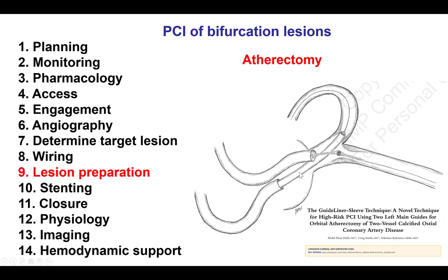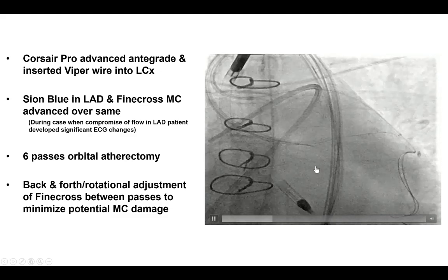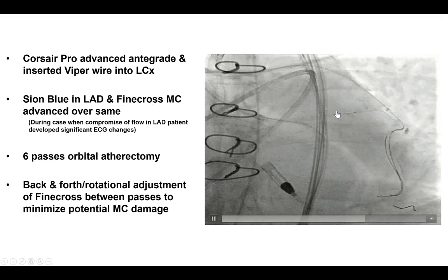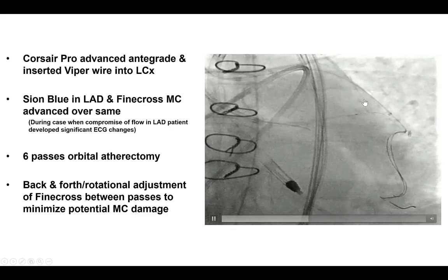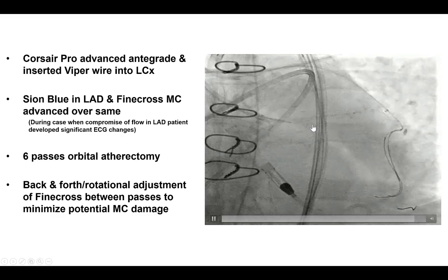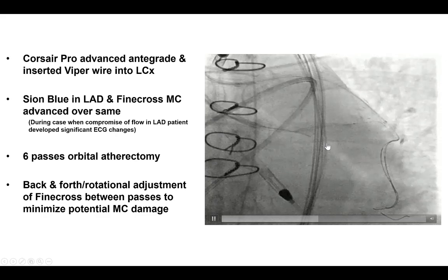One way to handle this is to use two guides and use a guide extension to protect the wire in one vessel while performing atherectomy in the other vessel. The other option is to use the guide extension over the wire used for atherectomy to protect the secondary wire into the side branch. What we did in this case was to insert a FineCross microcatheter over the LAD wire to protect it, then perform multiple orbital atherectomy runs into the circumflex. While doing that, we changed the position of the FineCross to minimize injury at the same location.